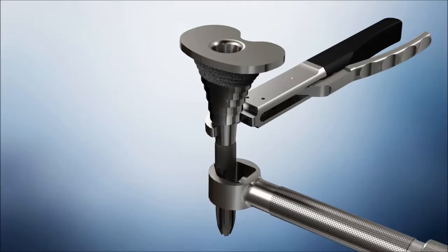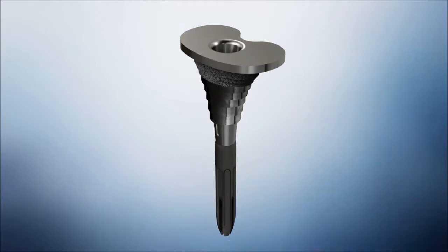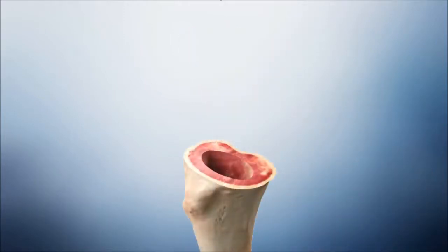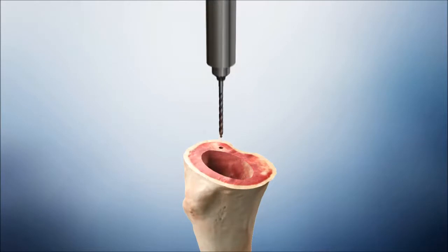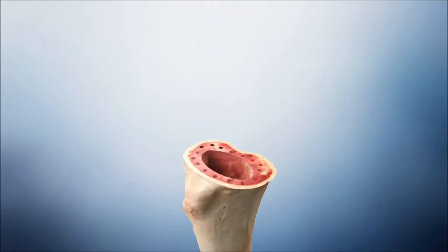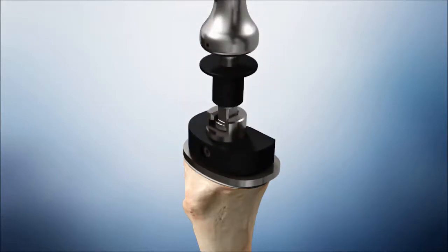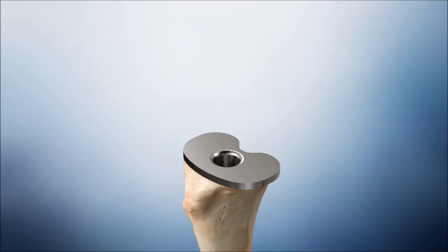Enlist the proper cleansing and cementation technique. Perforate the prepared proximal tibia with small drill holes to facilitate penetration of bone cement. When a fluted stem with a metaphyseal sleeve is used, ensure the medullary canal remains free of cement. Seat the tibial implant construct into the prepared tibia by impacting with the RP tray impactor and universal handle assembly.